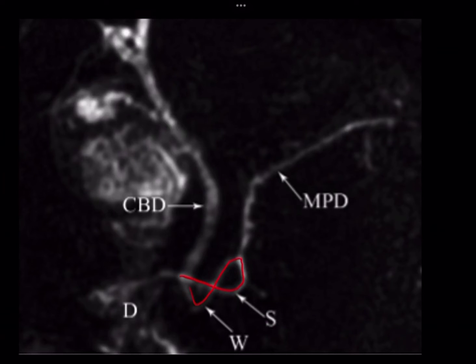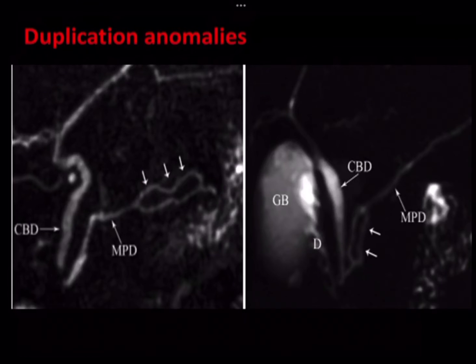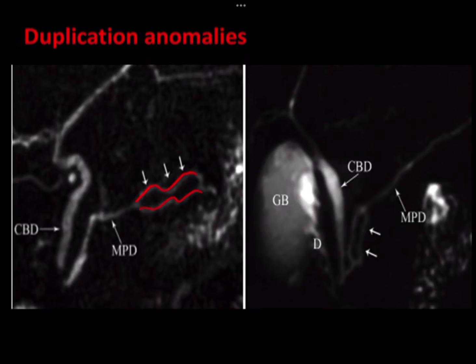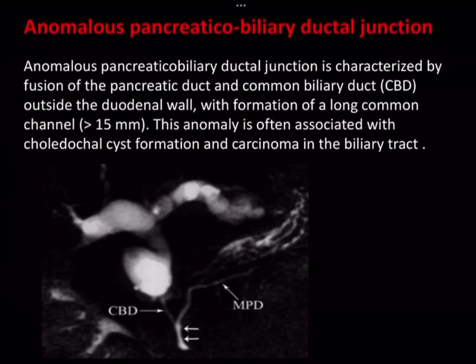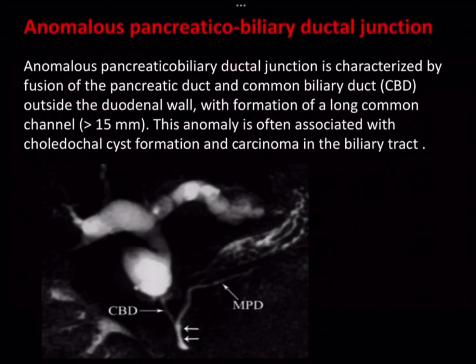On MRCP, we can see ansa pancreatica — the duct of Santorini taking a reverse S-shaped curve and communicating with the side branch of the duct of Wirsung. Next are duplication anomalies; on MRCP images we can see focal duplication of the pancreatic duct in multiple examples.